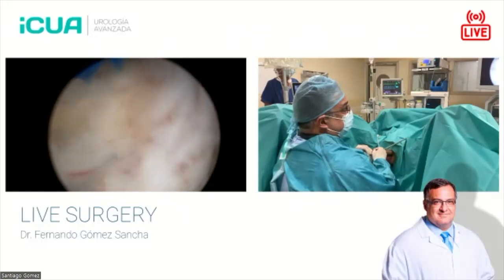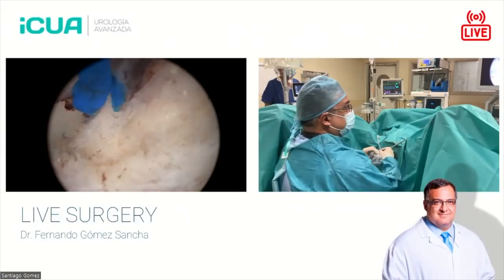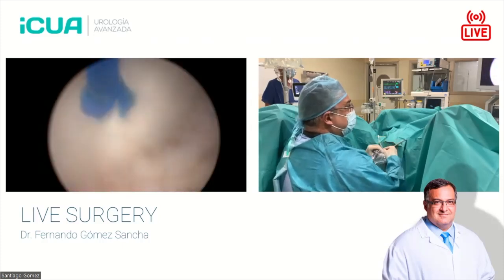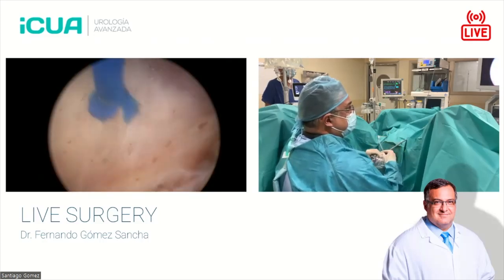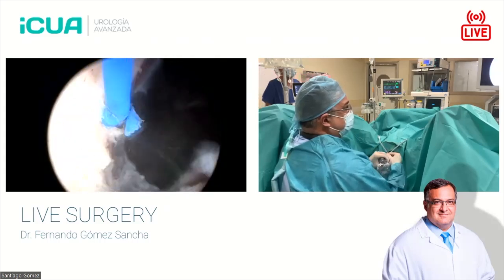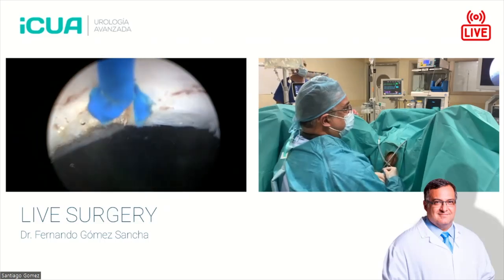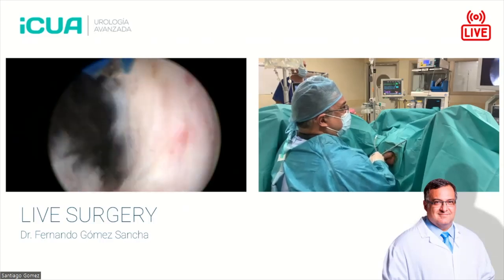I understand. And my setting has evolved a little bit since we started the operation. For the first 2 years I was using 2 joules 50 hertz. Then I went a little bit down with the energy until 1.5 and 60, and now in the last year or year and a half I'm using 1.2 and 70 with virtual basket. I feel comfortable with the settings.